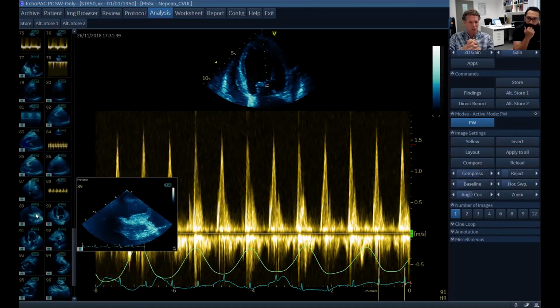It can be very treacherous because you've got the LAD that can be down there, you've got the LV there. You do not want your needle anywhere near either of those, and that can absolutely kill patients. The safest approach is under the xiphoid, but you have to go through a lot of liver to get there. It's often a bit further. I sometimes find the drain gets stuck in the diaphragm in younger people. And that's why I look more to the apical approach, but recommend doing that with someone who's done it before you have a crack at it.